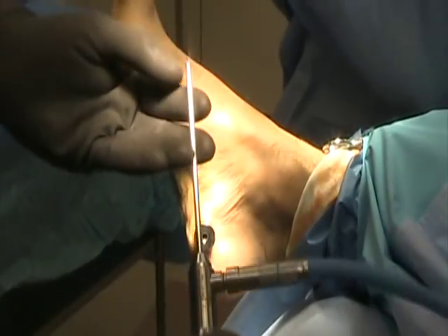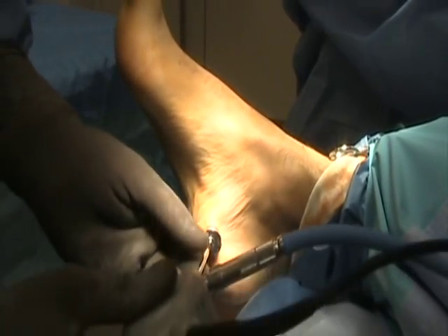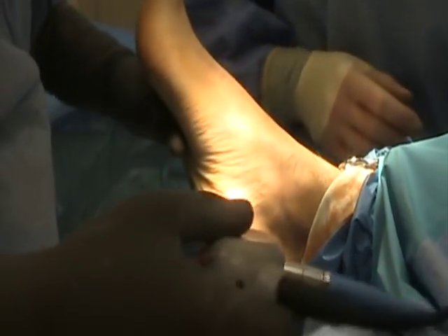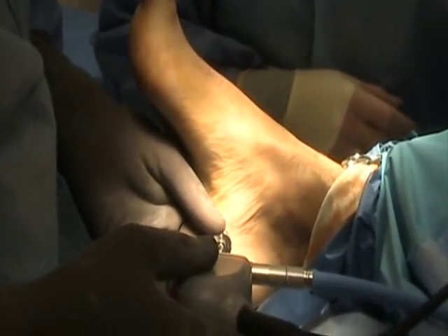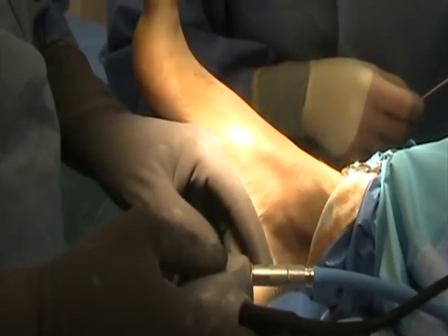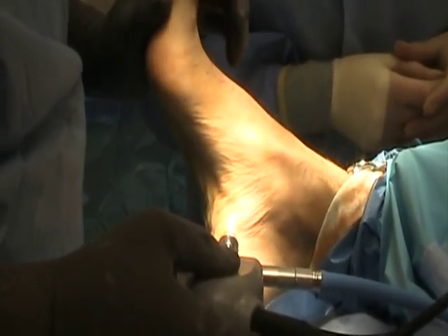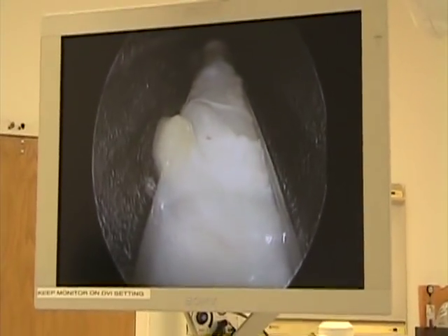Then we've got a 30-degree angulated scope that we introduce in. What we're looking at here is the white that we're seeing at 6 o'clock — that is the fascia through the slotted cannula.